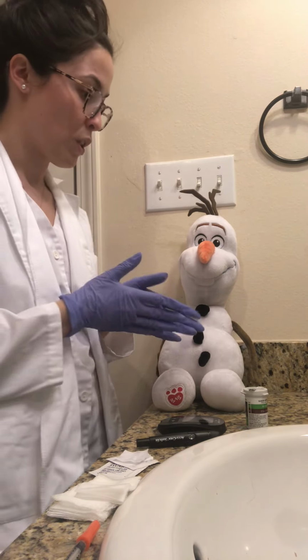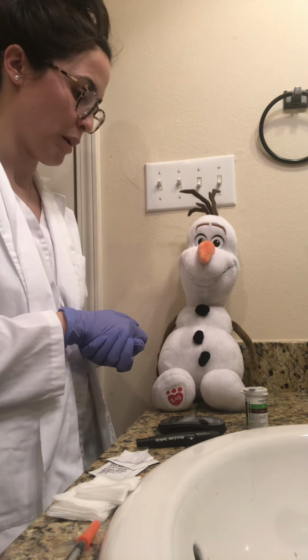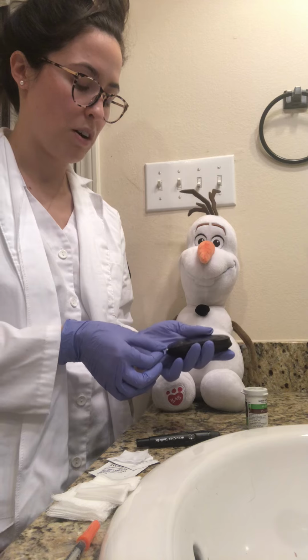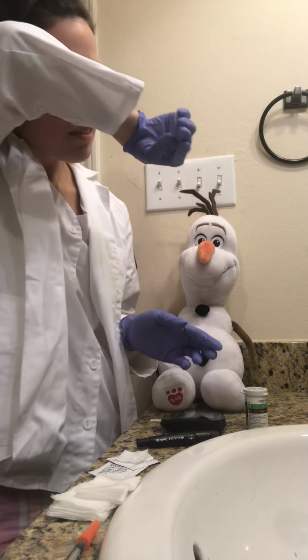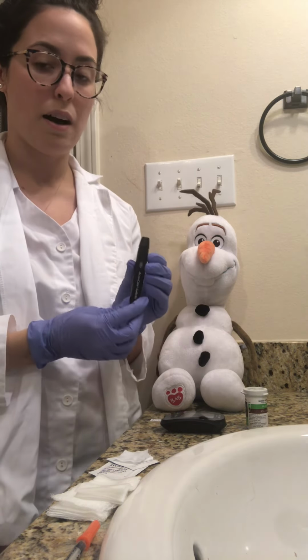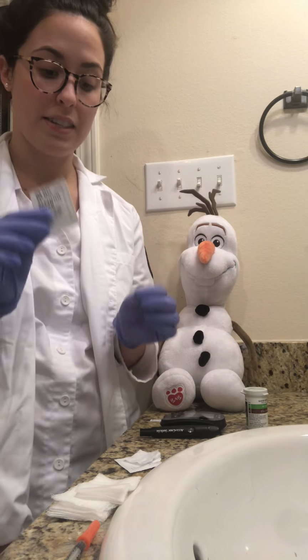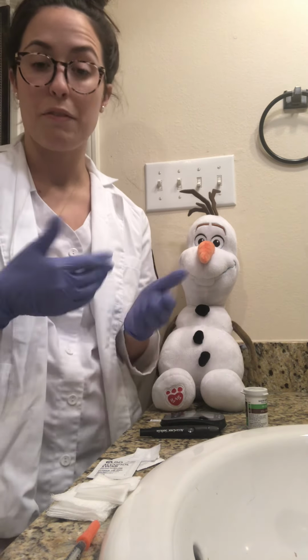And now, Mr. Olaf, I'm going to get you to go wash your hands real fast while I set up all my materials to get your blood glucose. This here is the monitor to measure the blood glucose. I'm just going to insert one of these strips that we add the drop of blood onto, and that will turn on the monitor. I also loaded a clean lancet into this machine that is going to stick the patient. And I also have an alcohol swab here so we can clean the site of injection, and some gauze for any leftover blood.